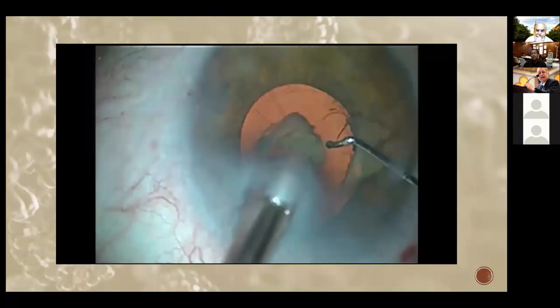If I start doing divide, start sculpting, it's going to be running left and right in front of me. I don't think I'm going to be able to do divide and conquer. Exactly, a moving nucleus is very hard to do divide and conquer. So you need to have a stable, non-moving nucleus in order to do divide and conquer. Thank you, Dr. Wael.